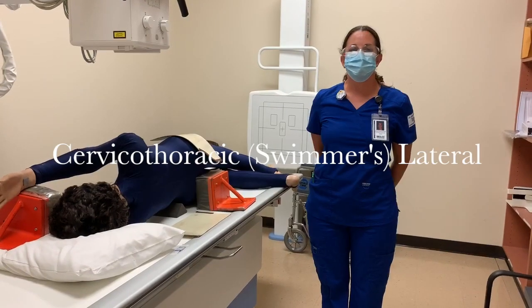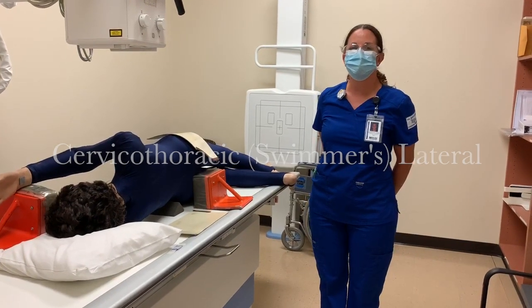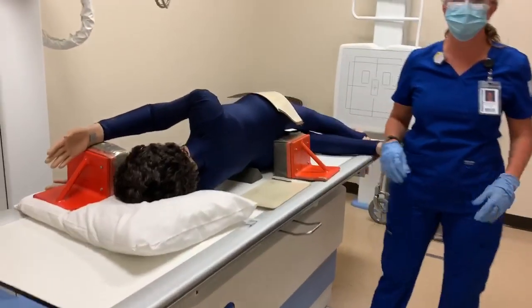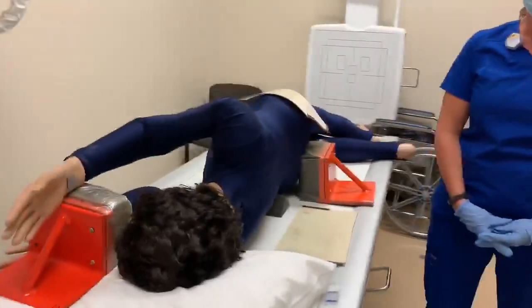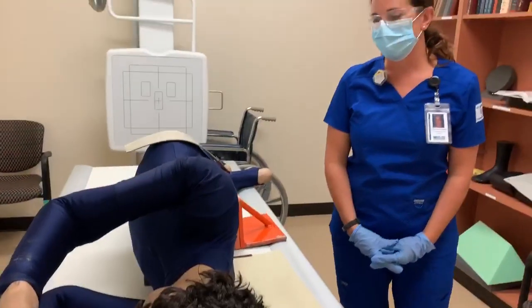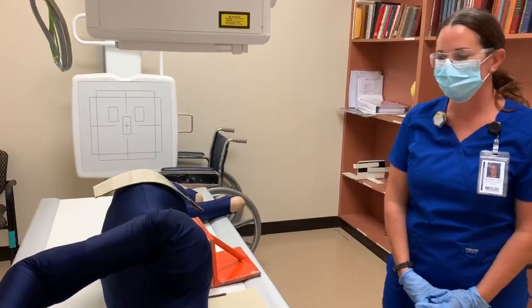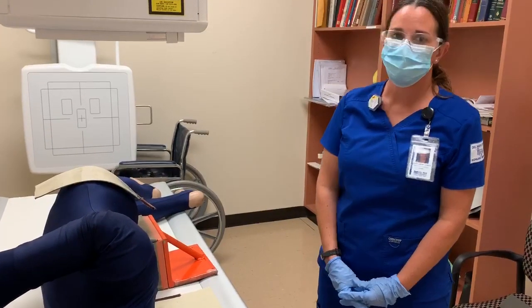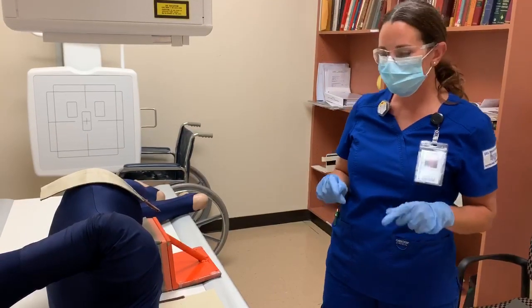Hi, my name's Andrea Lindquist, and I'm going to be taking over from Liliana's spot. Since our patient is already in a lateral position, I'm going to be demonstrating the cervical thoracic lateral, more commonly known as the swimmer's projection. This is used when C5 to T3 is the area of interest.